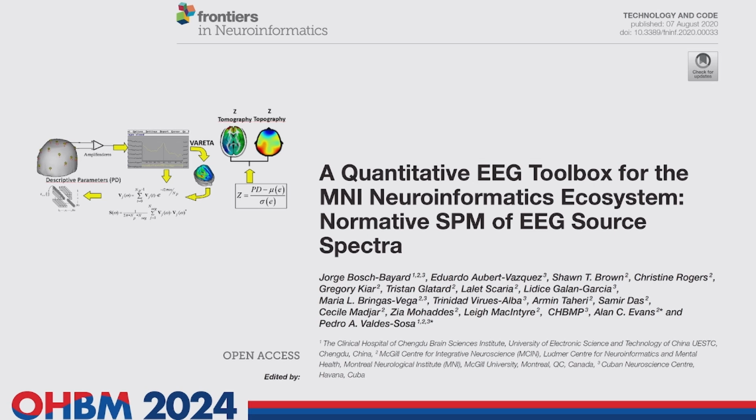And then we have the harmonized qEEG, a multinational effort that we made in 2022 within the Global Brain Consortium, bringing together scientists of many countries, and I will explain the new things that we add to the quantitative EEG analysis.